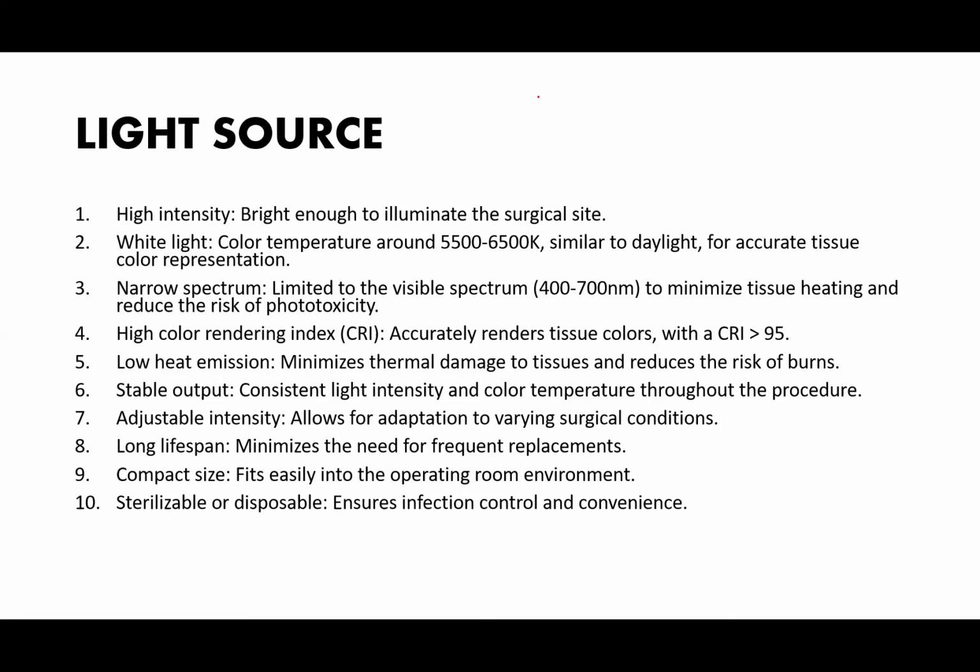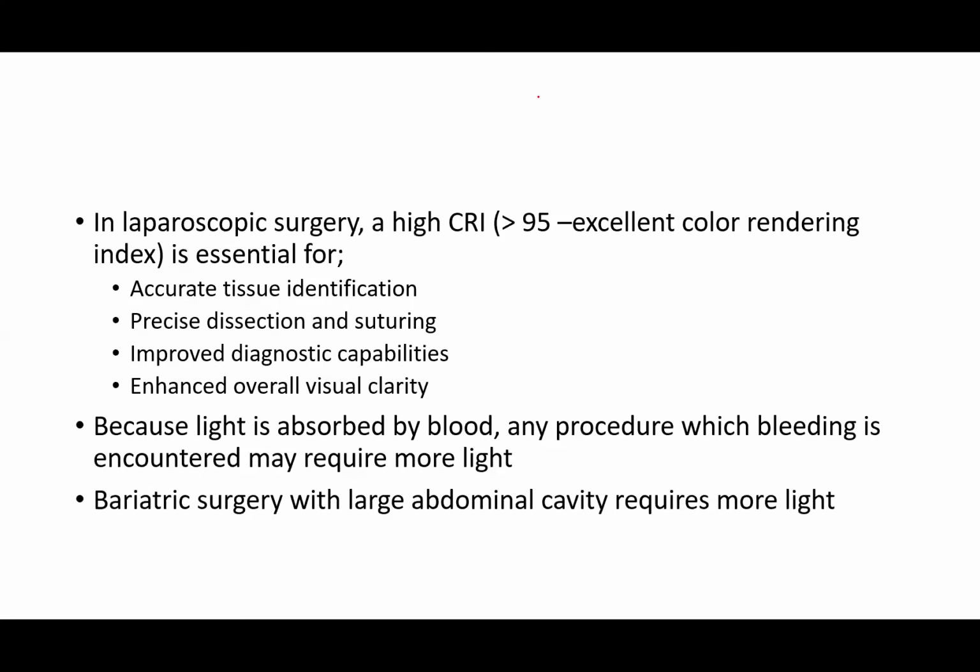Now, it should have a compact size, fit easily into the operating room environment, and it should be sterilizable or disposable. This ensures infection control and convenience, so you can clean up the cable. Now, in laparoscopic surgery, a high color rendering index of greater than 95, that is excellent color rendering index, is essential for accurate tissue identification.